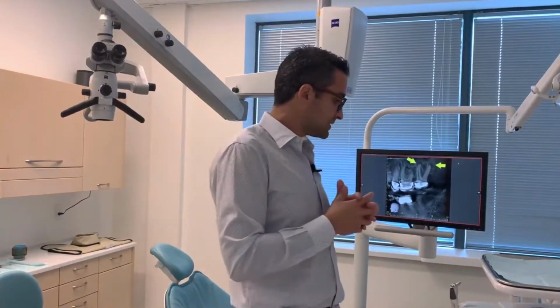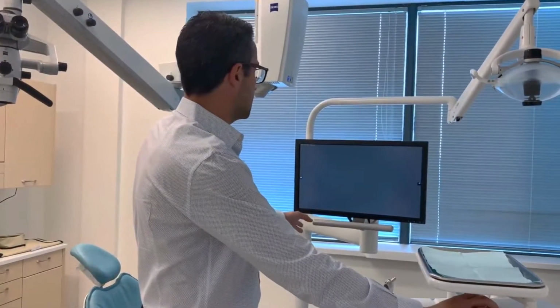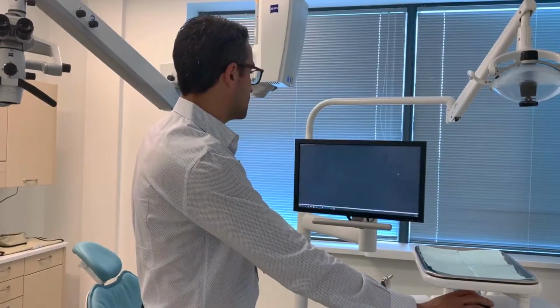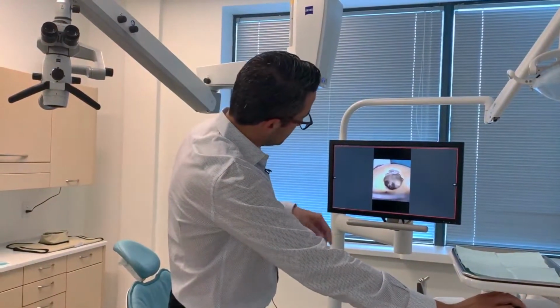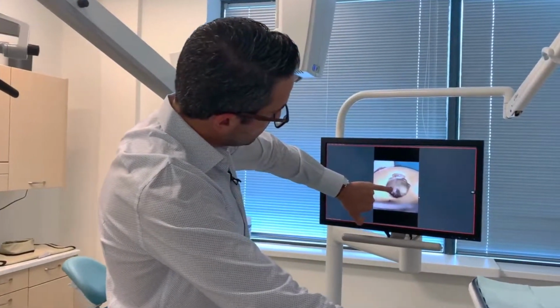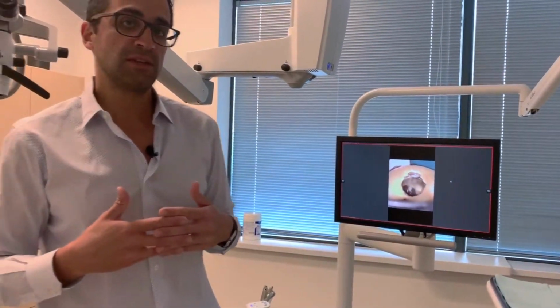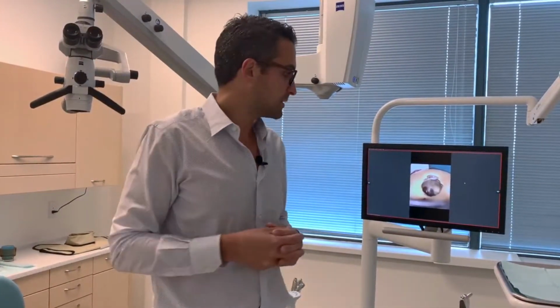So back to our case here, as I was cleaning the tooth and I looked inside the dental operating microscope, I was able to see that there was a crack inside the tooth that I could not see with the CBCT. As we can see here, there's a line that goes from the distal marginal ridge all the way down into the palatal orifice, which really explains why the patient is in pain. So the tooth got cracked. The crack is a point of entry for bacteria, for saliva. The tooth got infected and the patient is in pain.